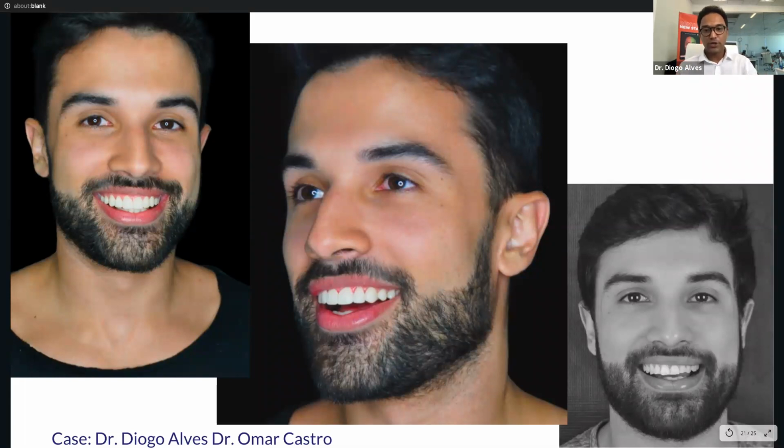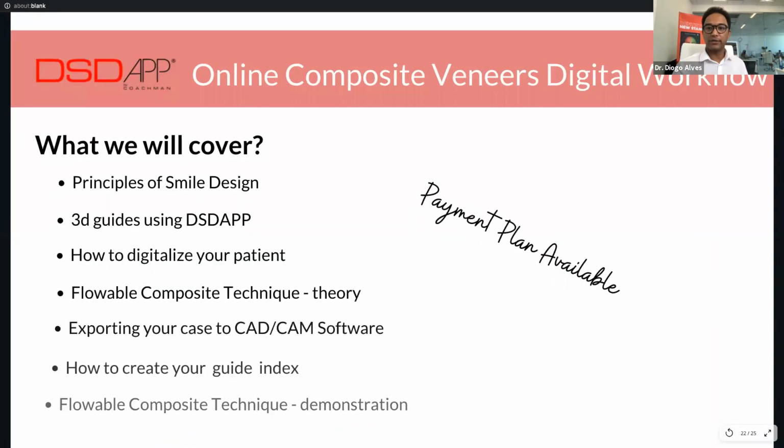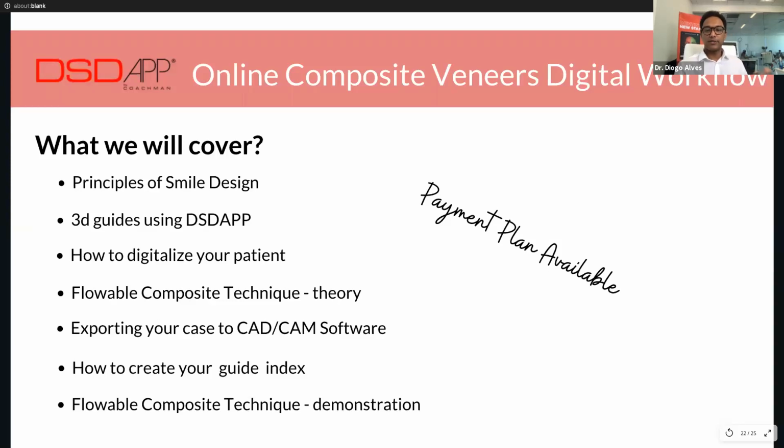So for those who want to know more about this course, I want to show you here what we will be covering. Diana, can you explain them a little bit more about it? Yes, of course. Do you think that you can implement this in your office and impact a lot of lives doing that, like in 2 hours, Diogo? So we can do my simulation, and I need to mention that my simulation in the iPhone version is also very quick, so you can impact a lot of lives during the first appointment.